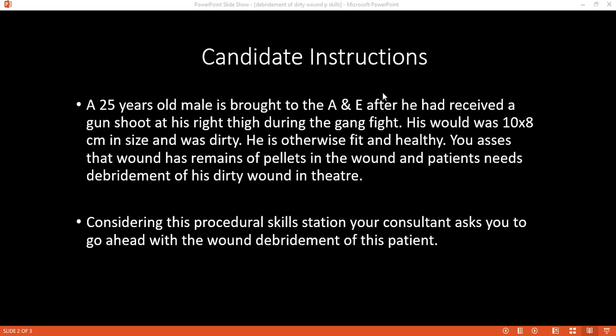After that, I will check the extent of the wound. And I will remove the non-viable necrotic tissue, and I will also irrigate the wound. After irrigation and cleaning the wound, I will completely excise the necrotic tissue. Or I will do more excision of the wound. I will pack the wound with povidone iodine or saline gauze piece or alginate dressing, whichever is available, and or negative pressure dressing.